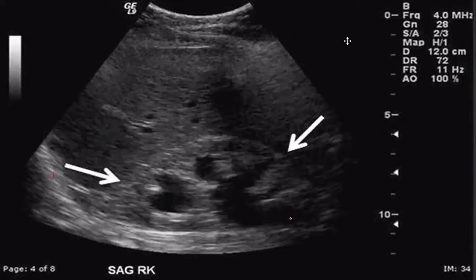Because the ureters are normally filled with urine, that's why it's black. But because of the overpowering of the gases, they tend to be obscured normally. But if they are dilated because there is an obstruction somewhere in the distal portion, they can now become visible. Meaning to say, if you see the ureter like that, it is already dilated. Okay.